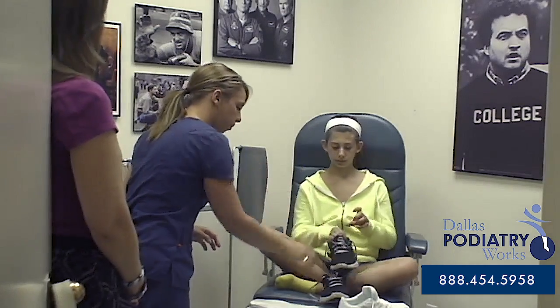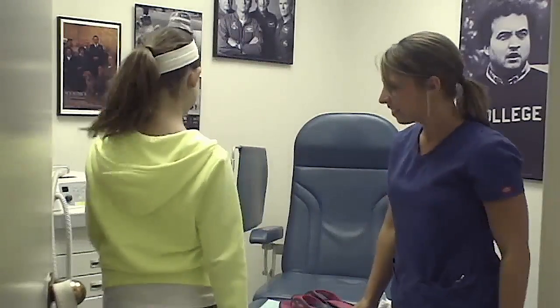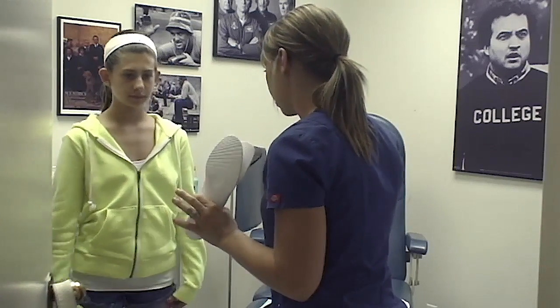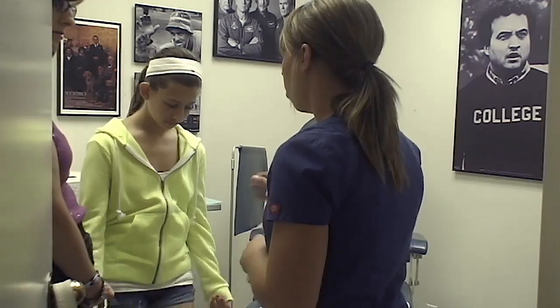Go ahead and try those on and tell me how they feel. It'll take some getting used to, but you'll start to really love them, I promise. There is a 30-day guarantee, so when she comes back in four weeks to see the doctor, if she has any issues, we can definitely give those a tweak at no cost at all.